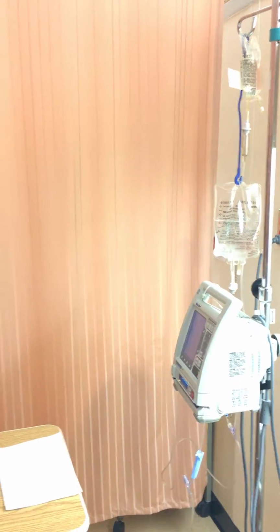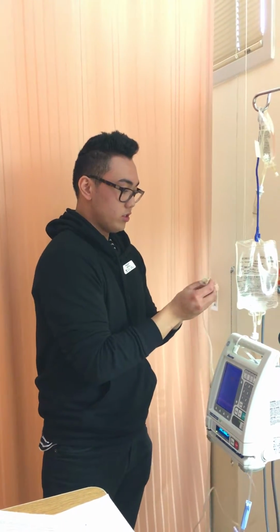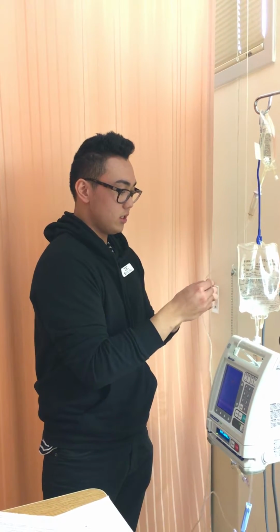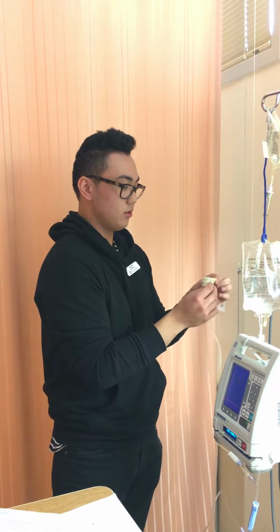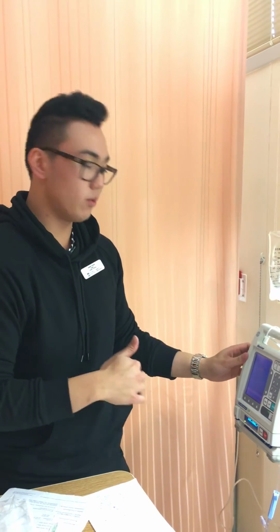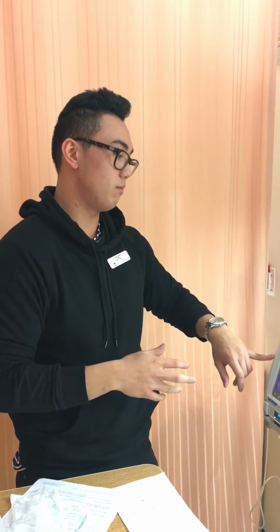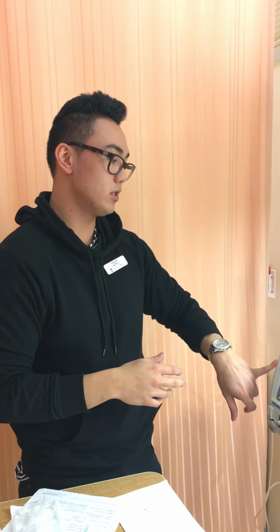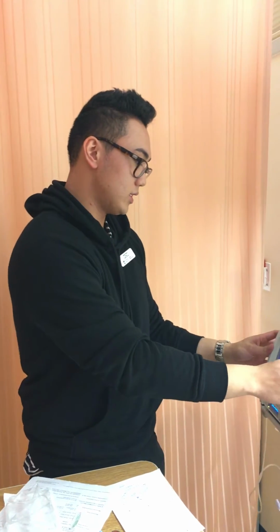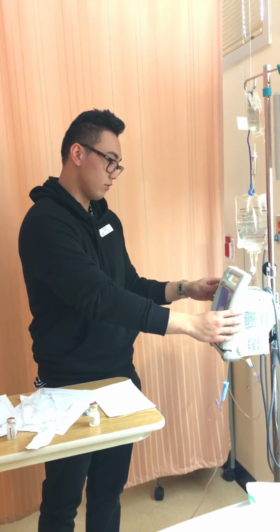And now we will label our line with the drug, the time we administered it, and the initials, and also maybe the rate of the medication. Okay, so now we will set the rate, which would be given over an hour. We have 107.9 milliliters of fluid, but the machine does not accommodate for that many numbers, so we're just going to round up to 108. So we're going to set that. So 108 milliliters an hour, 108 milliliters total volume.